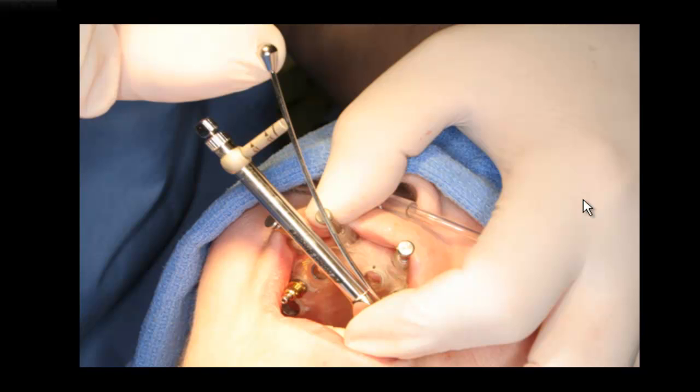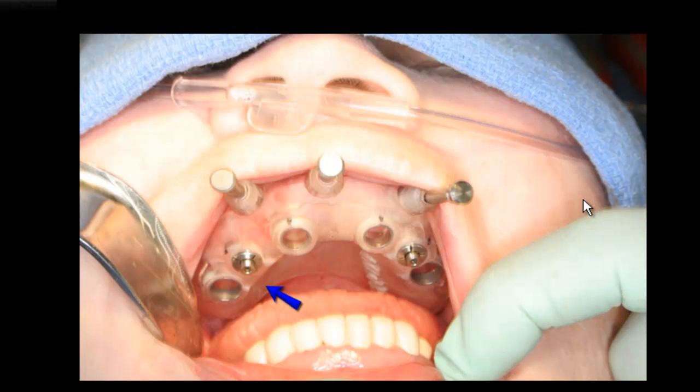When multiple implants are to be placed, it is recommended to work from side to side. For example, place implant number 5 to depth, then place implant number 12, then number 3, followed by number 14, etc. For additional support, leave the implant mount in the surgical guide master sleeve as you place your remaining implants.